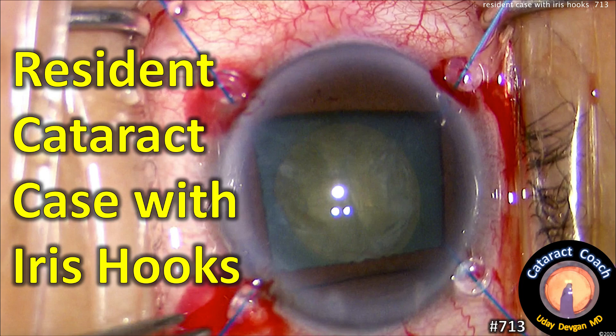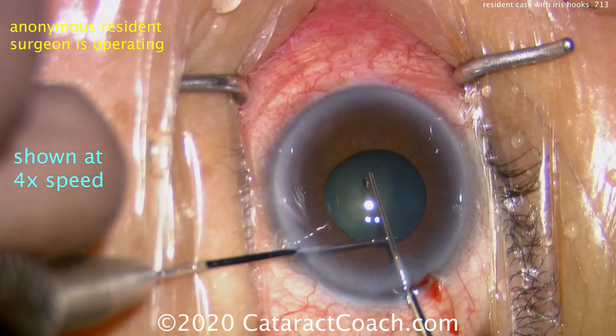CataractCoach.com — a resident cataract case with iris hooks. Let's learn from this resident so that you can be adept at using iris hooks also.